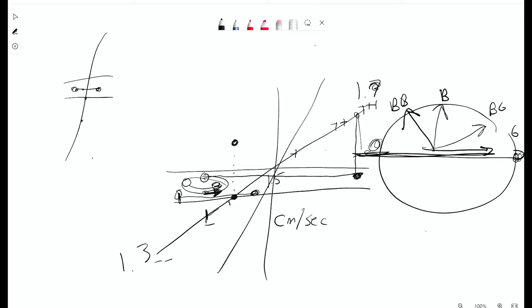Remember the VIBEs and the LAVAs, they say there's a 3 millimeter slice thickness, but they're really a 6. And so you throw those bad boys into an MPR or MIP, and they're going to look just atrocious. But if you get all three of them, you have that in-plane resolution that you can watch in all three planes. Nice. Something else, you could do a true FISP sequence, or a Fiesta sequence to get bright blood as well in the aorta. You could do like a gated true FISP or Fiesta sequence.